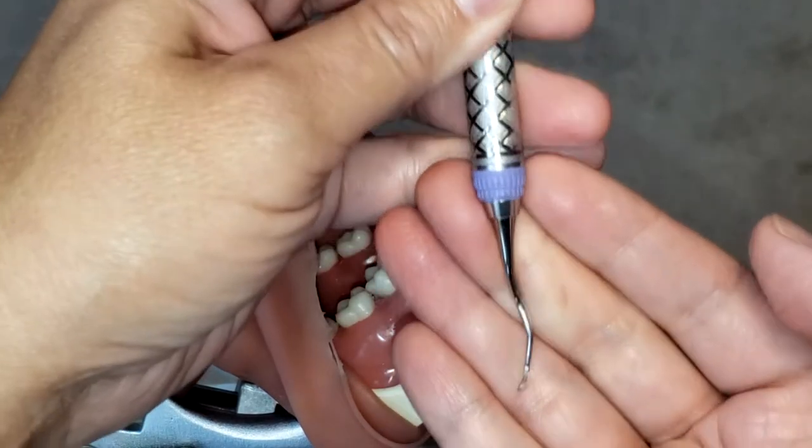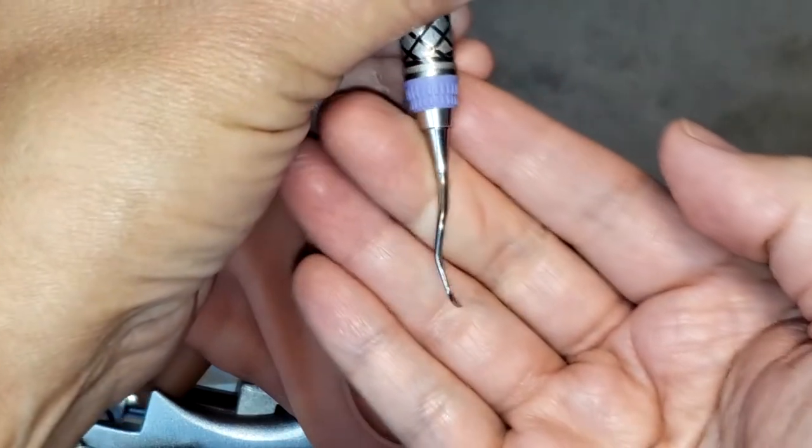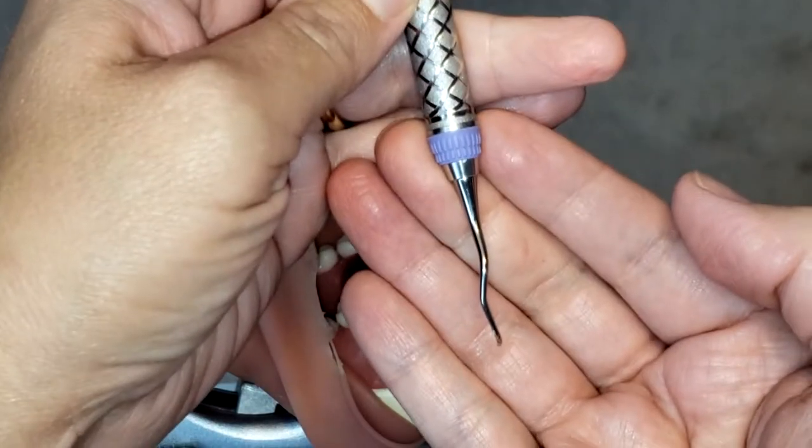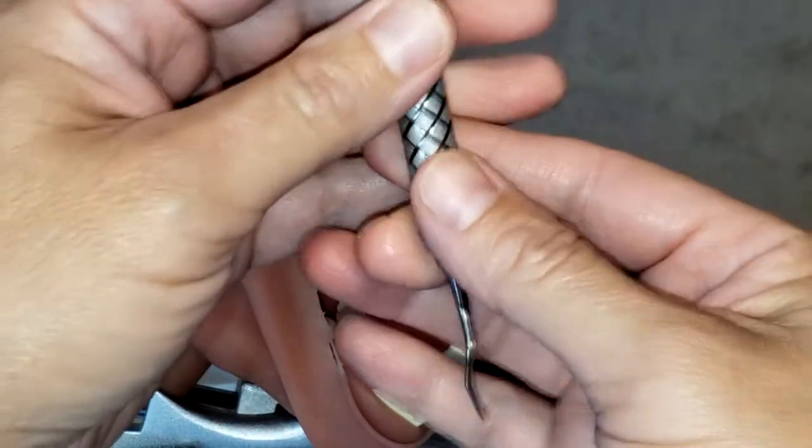This instrument is a periodontal instrument and it is only used for the posterior teeth on the mesial surfaces only — so molars and premolars.